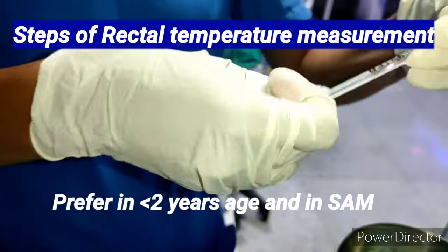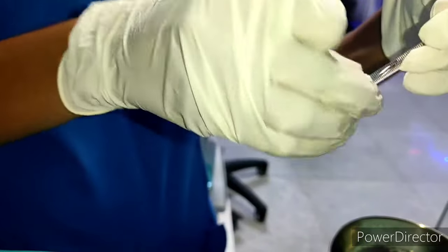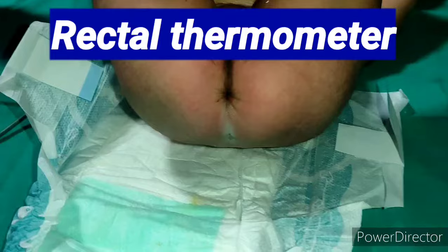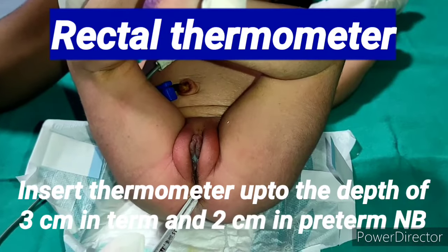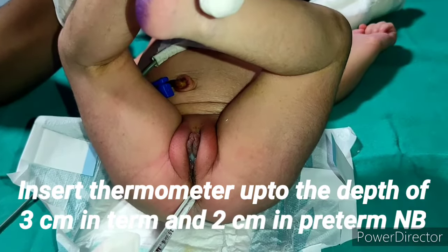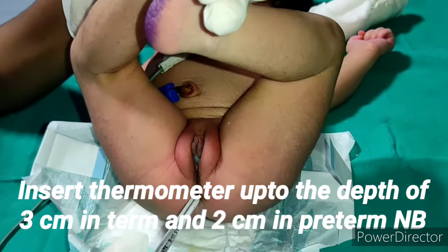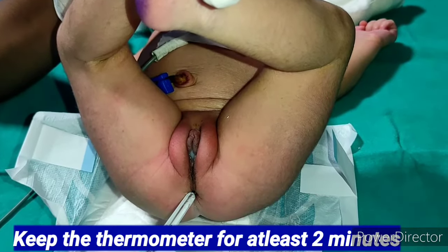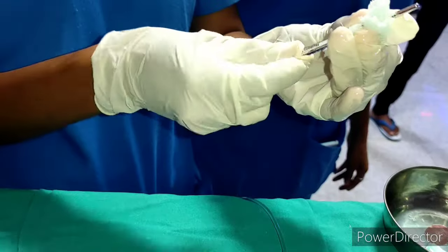I am now showing you the steps for rectal temperature measurement. This is preferred in children less than two years old and in severely acute malnourished babies. The rectal thermometer has a short and bulbous tip. We insert it to a depth of three centimeters in term babies and two centimeters in preterm babies, and keep it for at least two minutes.